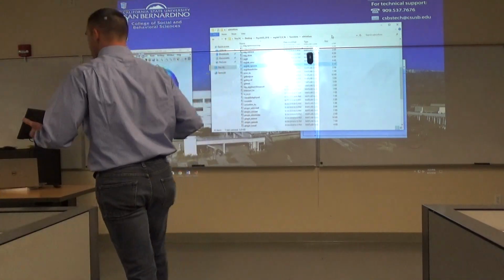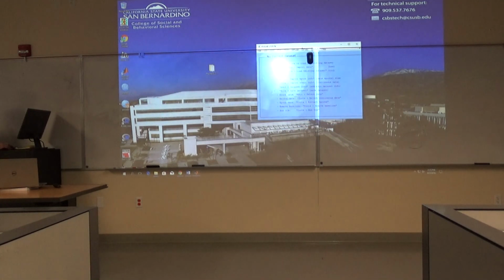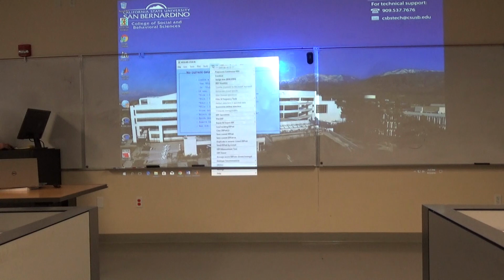Okay, so why don't you guys give that a shot then? Let's do what we were doing before. Let's walk through bringing up some of that data. Let you play with some of that. And so you're going to come up and go to ERP Lab. So see where I'm at here. You're going to ERP Lab and you're going to go to Load Existing ERP Set. Okay?